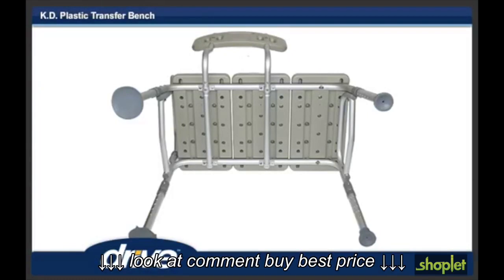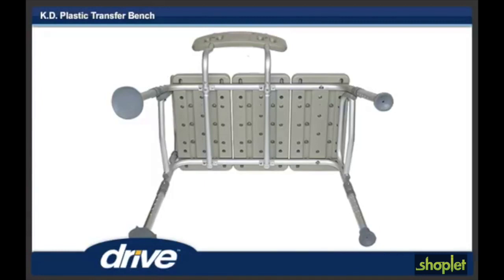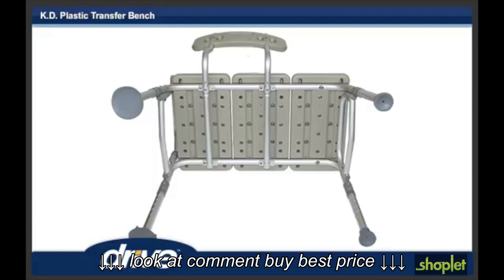Note: backrest must go through both sets of receptacles to become secure. Back support is reversible to accommodate left or right tub entry.